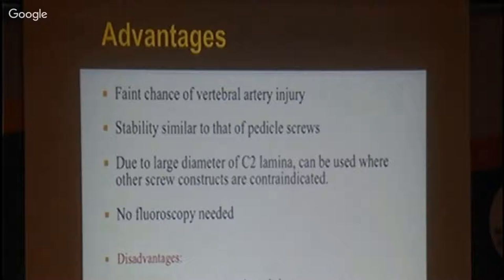It's difficult in connection sometimes with the C1 lateral mass, but since I don't do the connection, I don't know how difficult it is. Aman and Mohsin, how difficult is it? Because these guys put in the rod, so I don't know how difficult this is. And postoperative laminar fractures have been seen in some cases. If you're trying to put in two bigger screws, and you try to rotate in between, you can cause problems. But obviously you need to check that the patency of all four walls is intact. Any questions?